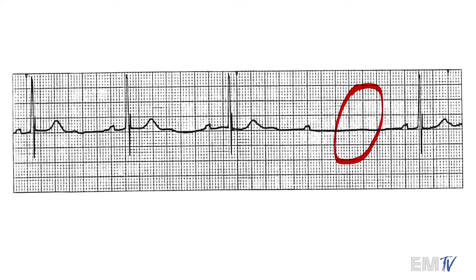If you look a little bit before that gap, you're going to notice a lone P wave. Having a dropped QRS complex with the presence of a P wave that precedes it is indicative of a heart block.